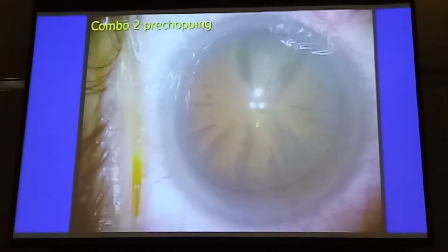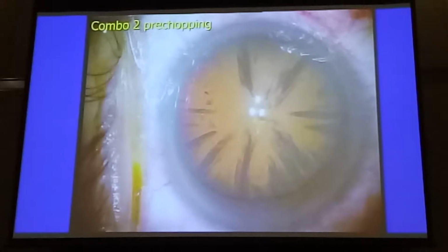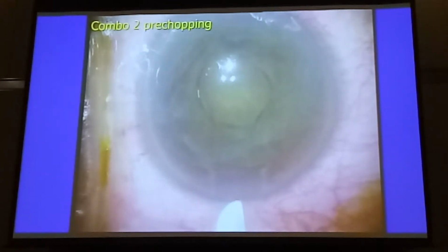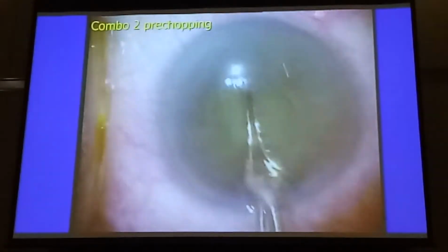And here let's have a look at one. I'm using the Combo 2 pre-chopper, which is a very good pre-chopper that Akahoshi designed years ago. This is a softish cataract, it's probably 1 to 2 plus. Now the important thing is after good hydrodissection, I put OVD to show the nucleus. Here's the combo 2 pre-chopper going in, pushing it into the nucleus, halved.